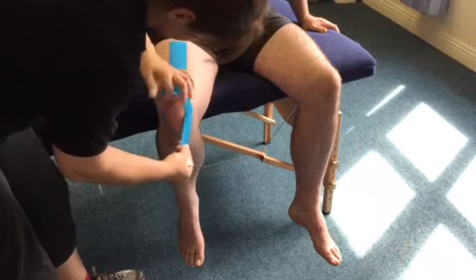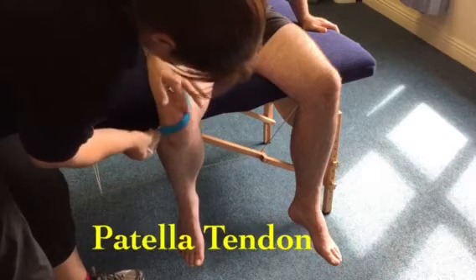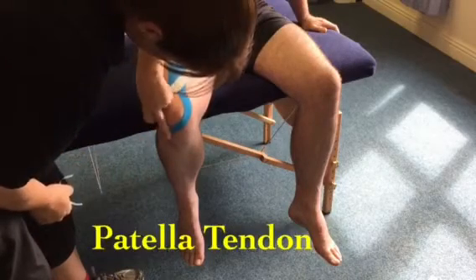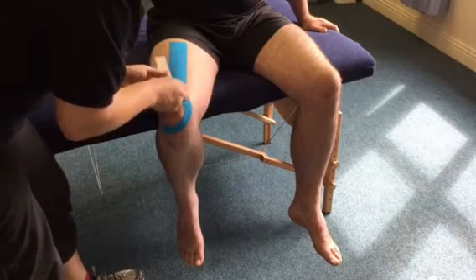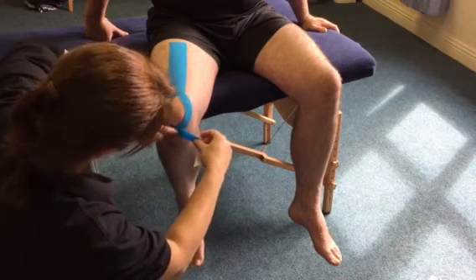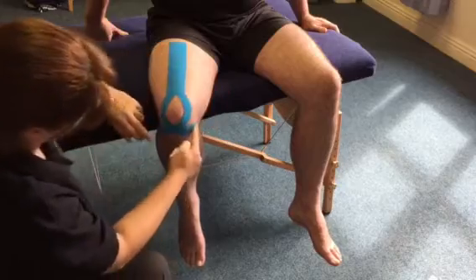I'm just going to follow the line of the kneecap in and around. That soft bit here is the patella tendon, where people have pain. No stretch on that last piece at the end. Same on the other side — 20 to 30 percent stretch down around the tendon itself, crossing over that point of friction, and again no stretch on the end.